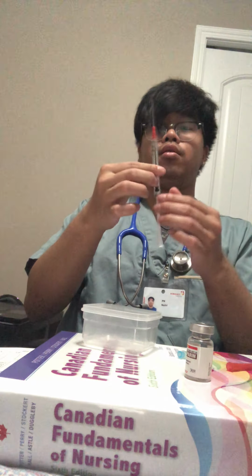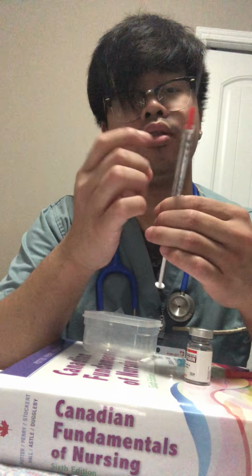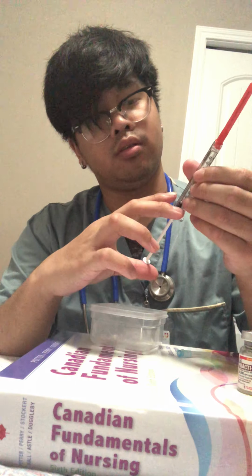I'm checking for any air bubbles, and if there are air bubbles, I have to flick it up. Then I'm going to draw up, and if there's excess fluid, I'll push it back to the 1 ml mark or put the rest in the sharps container.